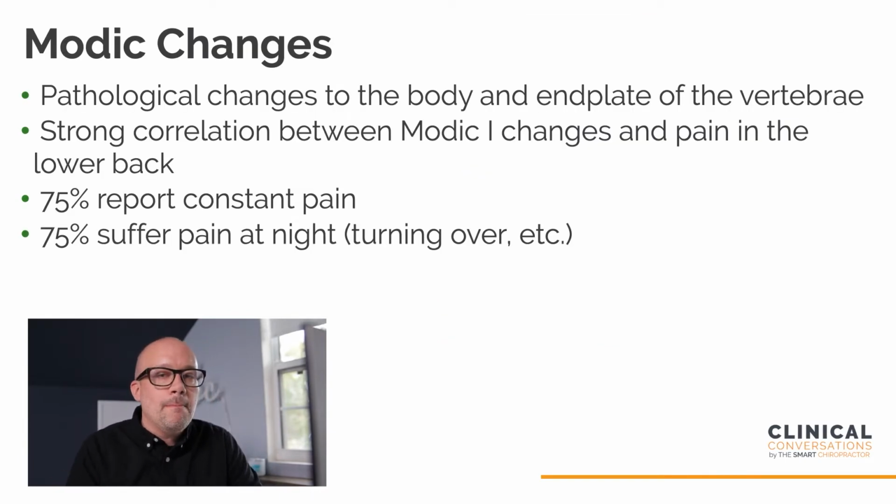So what are Modic changes? As you can see here, they're pathological changes. So they're not normal changes. Pathological changes to the body and end plate of the vertebra. I think we've all seen this on X-ray, certainly, where we've just seen that super white area, right? Or on an MRI where the bone just looks messy when it's meeting the disc. And sometimes I've even looked at Modic changes before on MRI and thought there was a serious pathology going on because it just looked sloppy and messy. Everything didn't look clean and nice like you'd expect it to on the margins. Those were Modic changes ultimately for that individual. So they're pathological changes to the body and end plate of the vertebra.